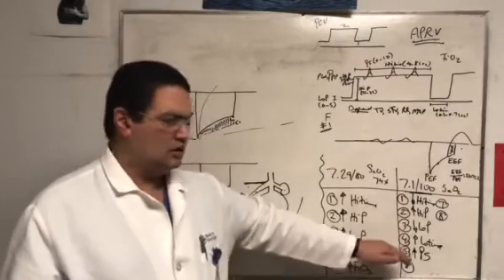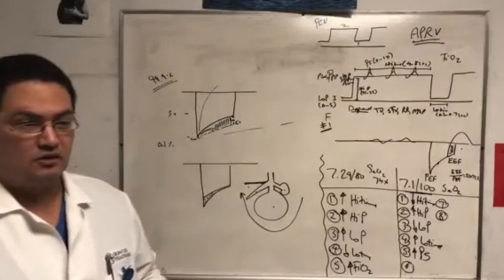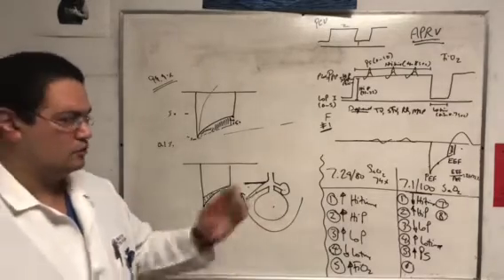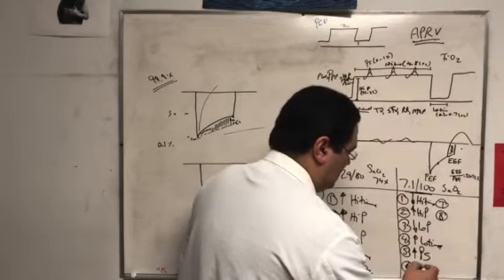So you're throwing in the towel very early. Why? Do all the others, right? And wait. At some point, everything is going to improve. Everything is going to recruit. If you just wait and go over the hump, then everything is going to improve, and you don't need to increase the low time anymore. All right. Last one. We have a couple here.